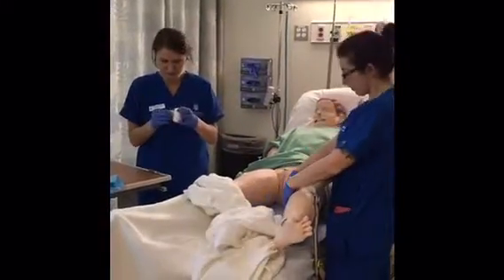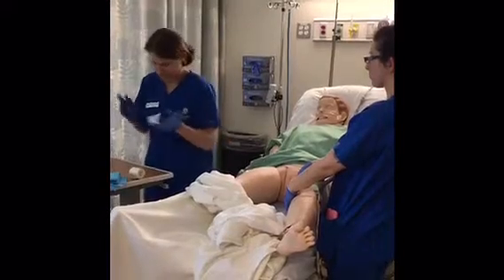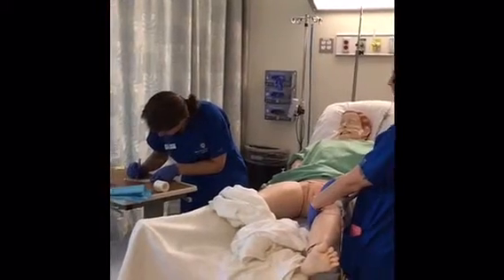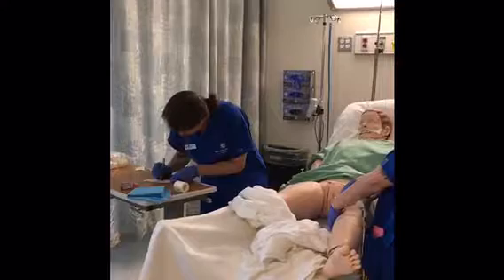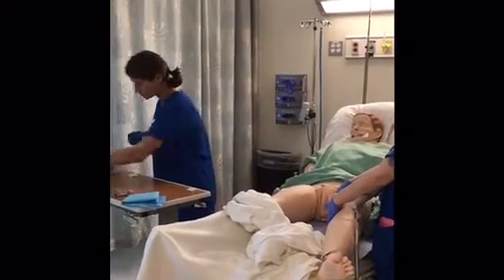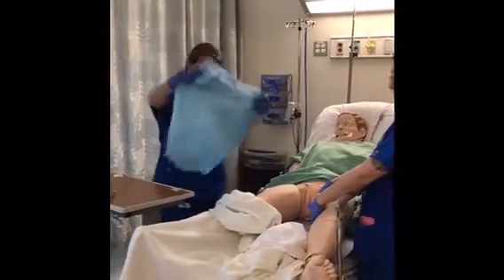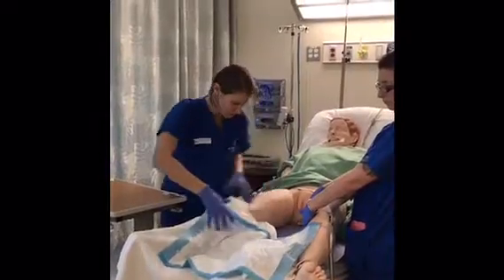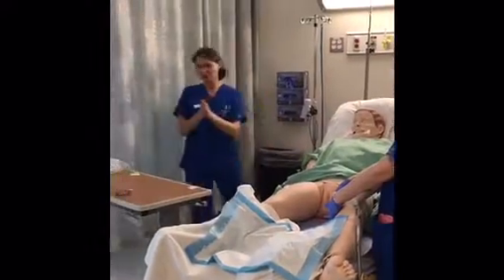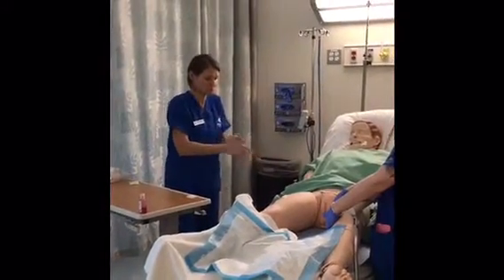I'm going to set up my tape to place the Foley on the leg at the end. I am then going to put my initials, put the date and the time. Place Chuck at the end of the bed for garbage. I'm going to remove my gloves, do hand hygiene, use antimicrobial sanitizer.